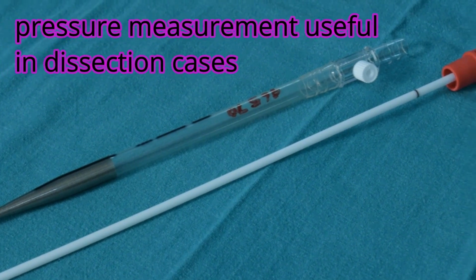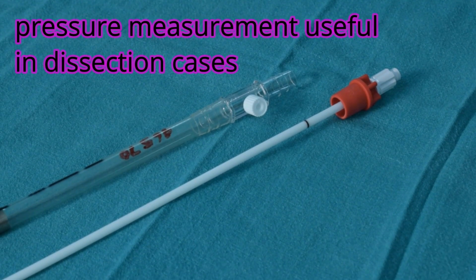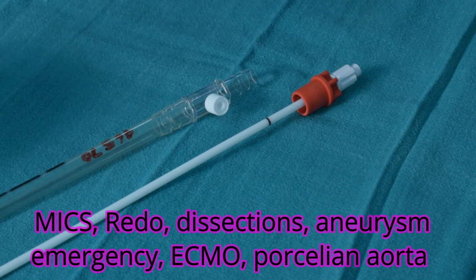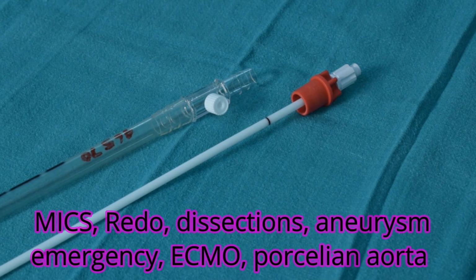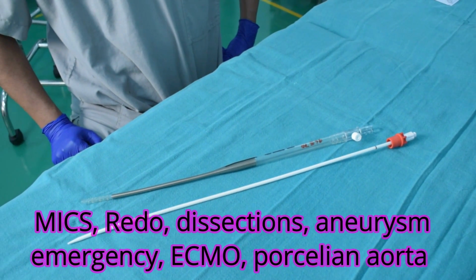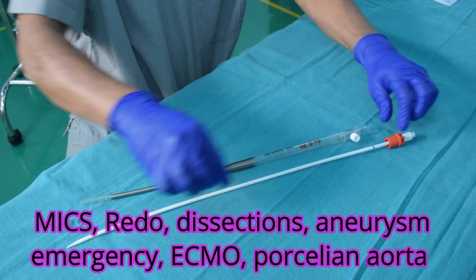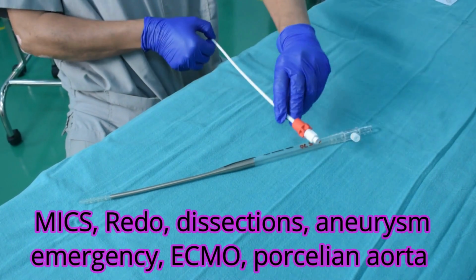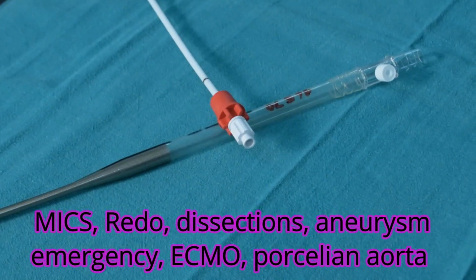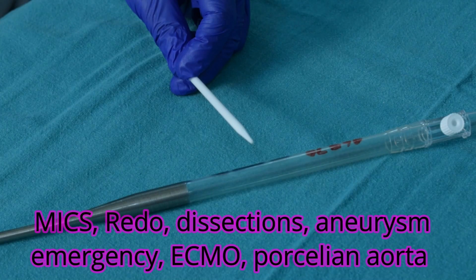But it also seems to be a very important means of establishing cardiopulmonary bypass, especially in patients who are undergoing minimally invasive cardiac surgery, redo cardiac surgery, in patients who have dissections, especially type A dissection, and you are in an emergency for a gross aneurysm of the ascending aorta, in emergency situations, almost all of the extracorporeal membrane oxygenation cases, and also in situations where the aorta is not amenable for cannulation, like the porcelain aorta, you can always go ahead and cannulate the femoral artery.